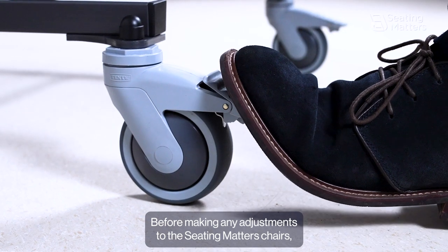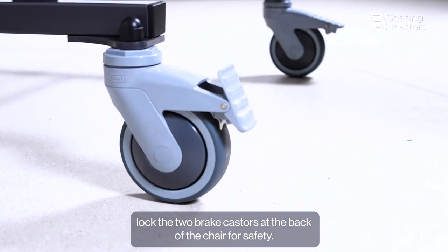Before making any adjustments to the seat, lock the two brake casters at the back of the chair for safety.